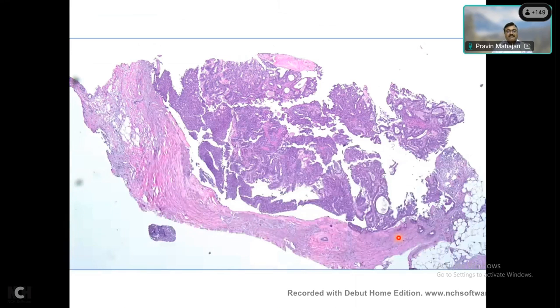Now, this is another example of an intraductal papillary lesion. This is actually a 14 gauge needle biopsy. It's a nice biopsy. You can make out a thick fibrous capsule of this lesion, or rather duct, and then you have this papillary proliferation here. You can make out it is papillary because even on the low power there is some sclerosed papilla here. Here some broad papillae you can make out, and if you look here in the periphery on the left hand side, one starts to see that there is some solid proliferation as opposed to this proliferation here, which looks more like a glandular or papillary proliferation.